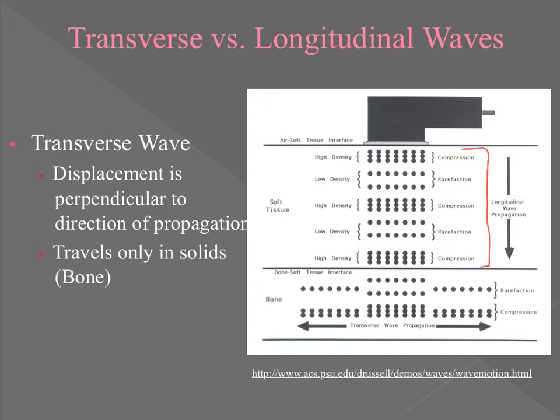What we know about the area of compression is that this is the region of really high particle density. And then we have rarefaction where we have a loosening up or a lengthening of that cord. And that's an area of low particle density. But we want that to happen. We want compression. We want rarefaction because just imagine, right? If you continue to stretch and then compress, it's creating what? More pressure to push that ultrasound wave down. So that compression and rarefaction becomes important.